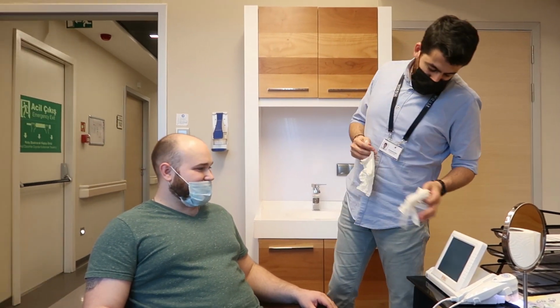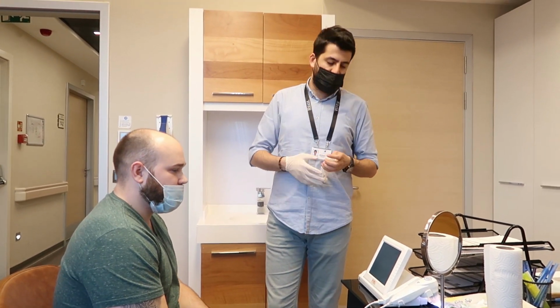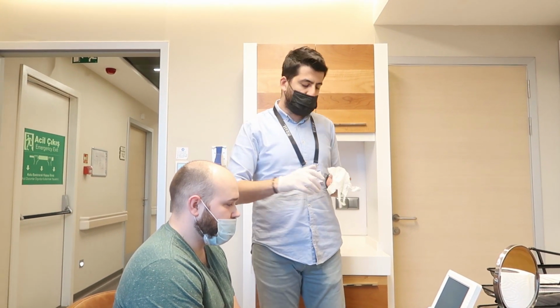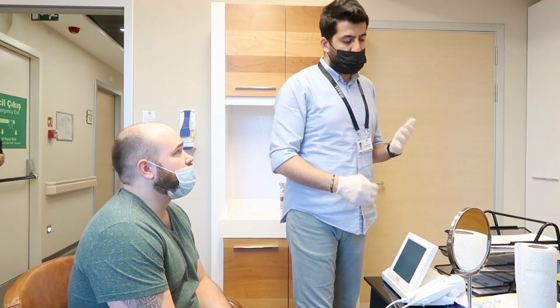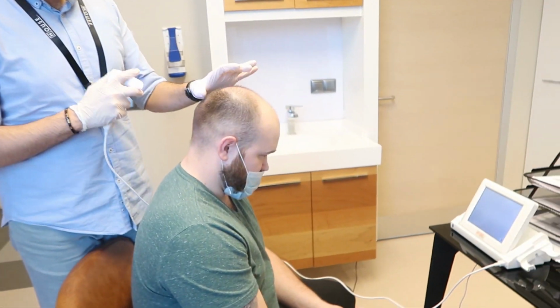So we'll start with that device, the dermoscope. Basically, it's kind of a microscope. It will show us your skin and grafts more closely, so we can make a better consideration. First of all, we will check the donor area at the back side of your head, and then we will go further to your hairline and see the whole area. After that, we'll decide the other details of the operation. You can see the screen at the same time with us.